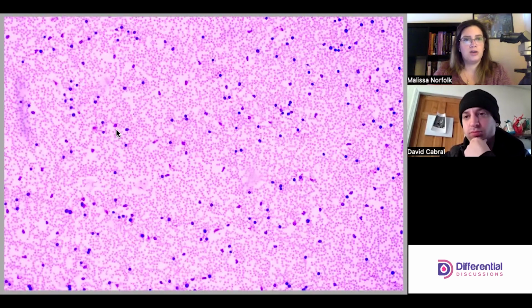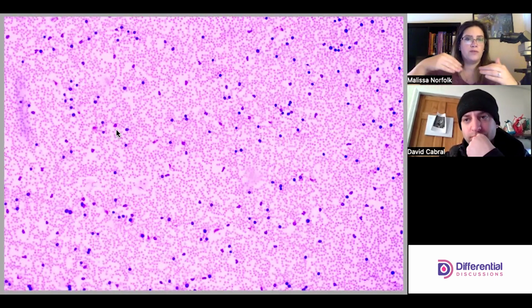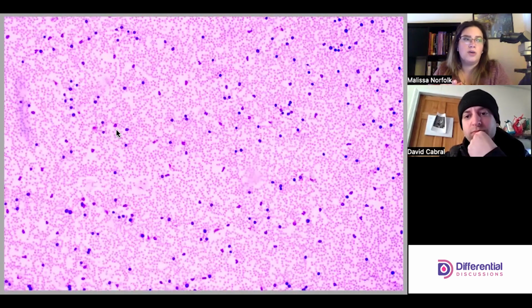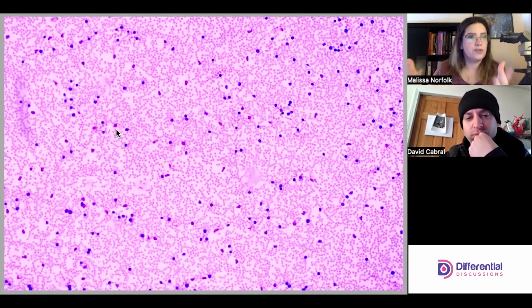Some hematology oncology doctors don't like to take the prolymphocyte count or the blast count from the albumin prep, and that will be dependent upon whatever chemotherapeutic regimen or whatever tool they are using to classify and distinguish their CLLs. So that'll vary from hemonc doc to hemonc doc. But for our purposes, if you have to use an albumin prep, we'll show you what that looks like too.